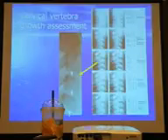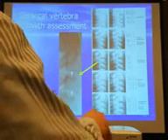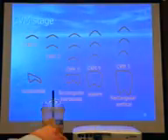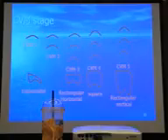If we use the collar to protect the child, then we cannot see the vertebrae, so we cannot evaluate the growth stage.